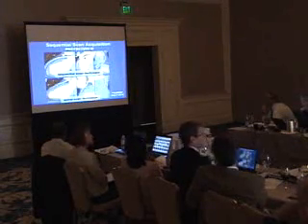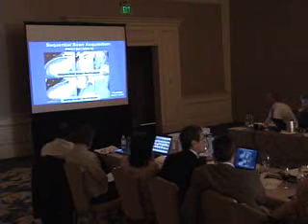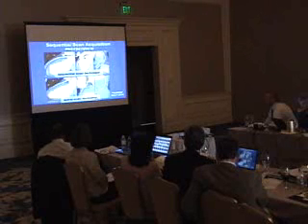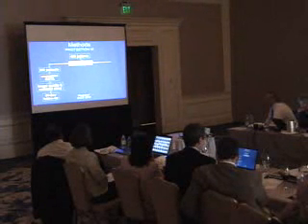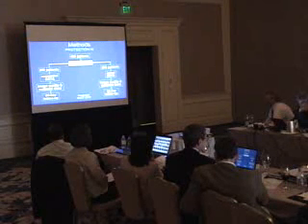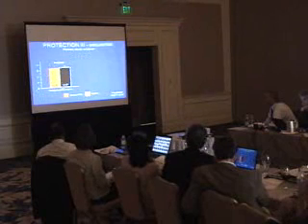Hausleiter, again, has really been taking the lead in radiation reduction with CT, and has performed a study called Protection 3, not yet published in manuscript form, in which he compared, in a randomized trial, sequential gating shown on the top to the standard spiral technique shown on the bottom. Patients were randomized to either sequential CTA, that's the prospective gating approach, or to spiral CT, the one that has been generally used in the past. He looked at image quality and radiation dose over the course of the study.